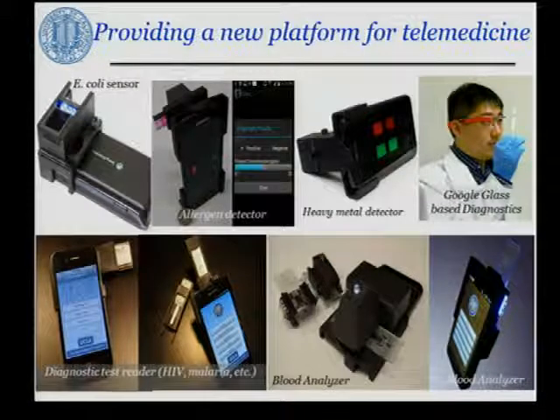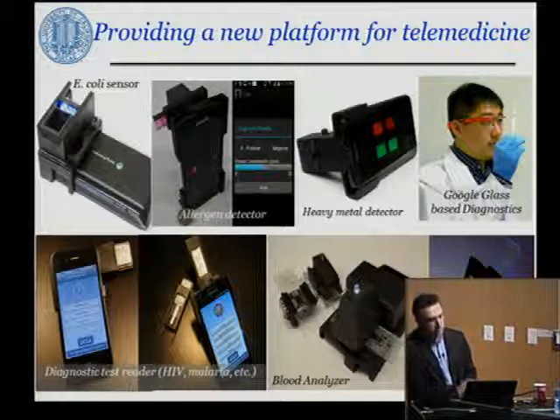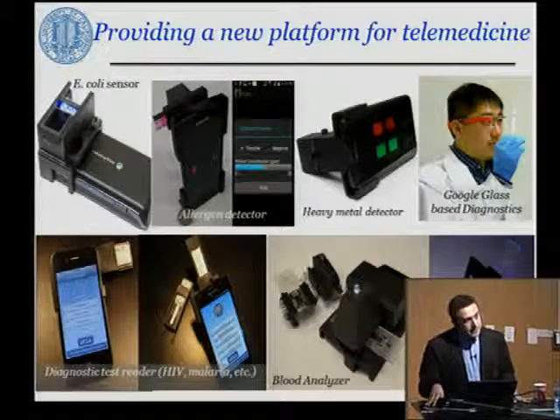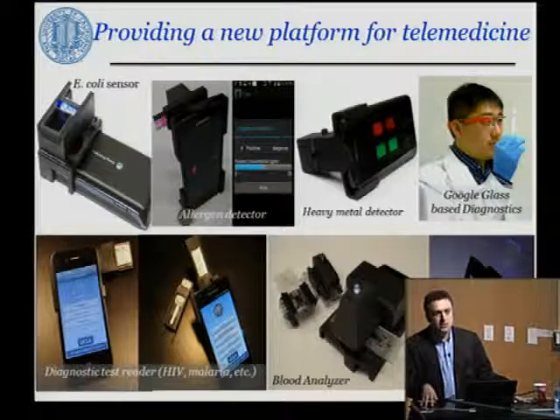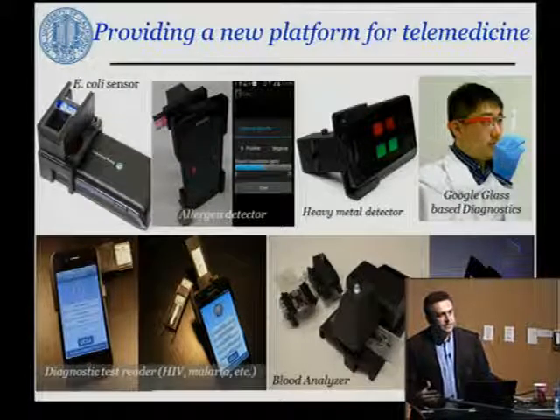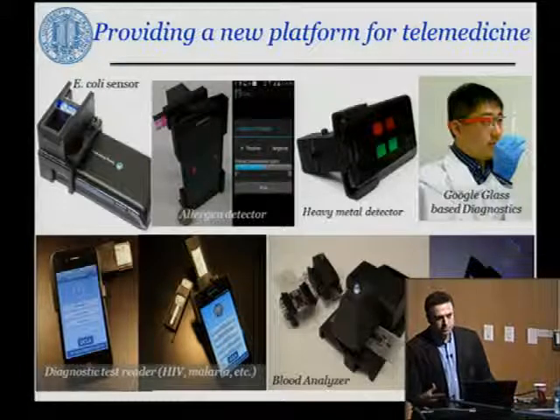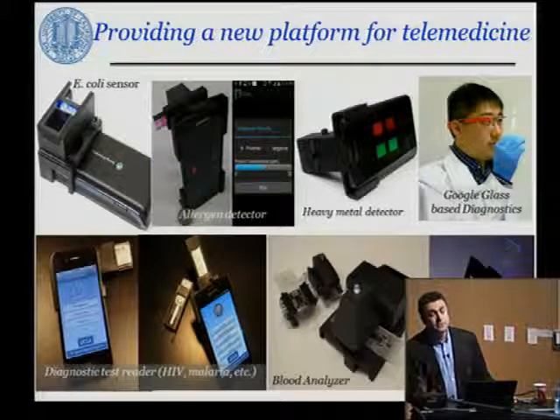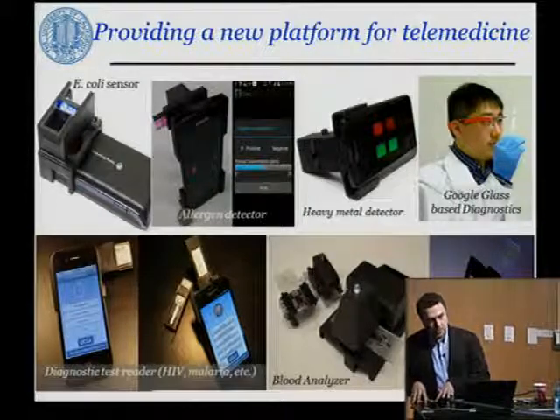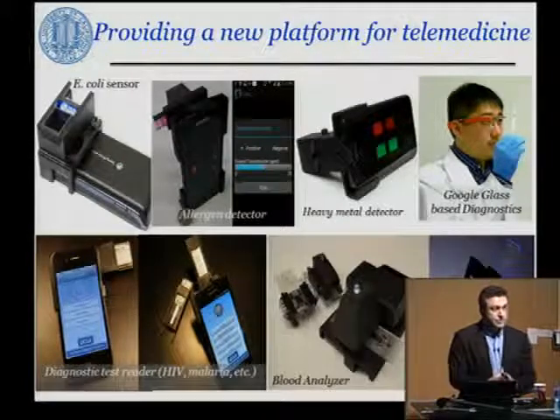So to conclude, I've described our work on the use of computation to create new kinds of imaging and sensing tools, with an emphasis on applications in mobile health, telemedicine, and global health, where the idea is to create competitive designs for these devices that would match the performances of traditional instrumentation that we have in advanced laboratories, so that some of these tests, measurements, can be done in extremely resource-poor settings. That's where telemedicine, that's where mobile health and global health come together.